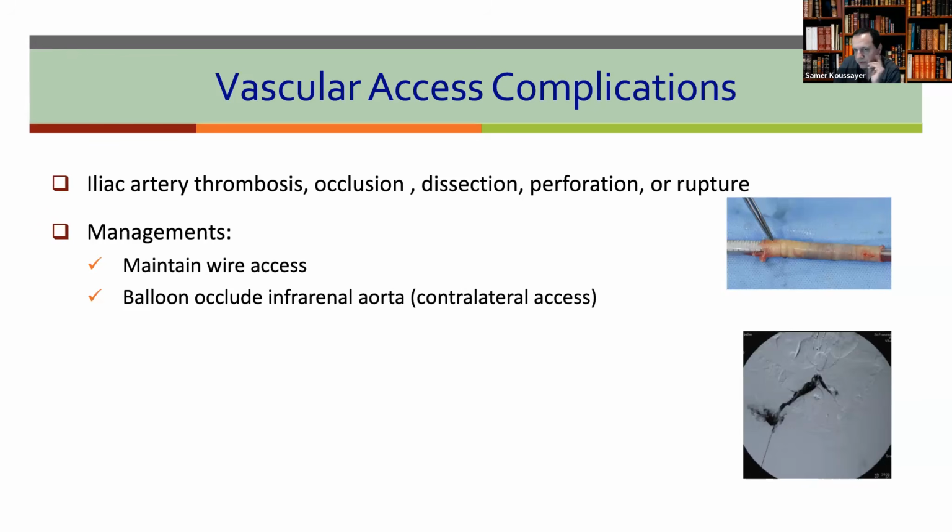If you lose the wire, then you have no other option, so you have to open. Then you do a flank incision. It's very easy, and you repair it with a graft or whatever you have to do.